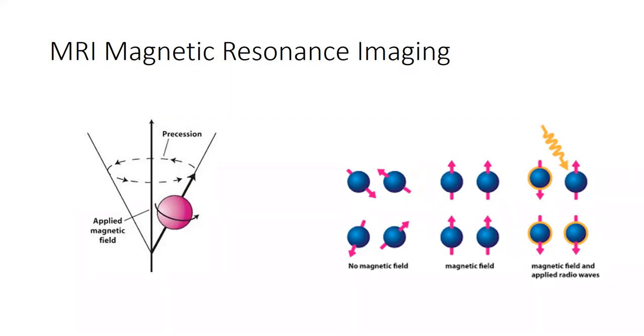Those are the echoes and the other frequency modulations that you do with MRI. When you zap it with radio frequency, it flips out of alignment. See how the arrows are all pointing in different directions, kind of random. And then you release it, the magnetic field snaps them back into alignment and they release a photon of energy. And you can collect that data just like a CT does, and you can map out the density of hydrogen ions, okay? Sounds a lot like NMR.